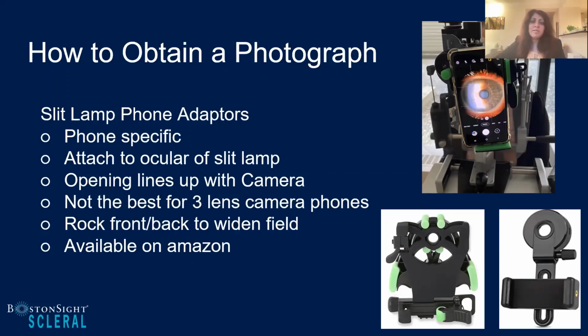And I bought a used phone that I kept in the office that was specifically meant for this setup. And I have used it for years and years and years, and it's only until recently that I got a new camera for the new office. But they work really well. And that technique of rocking, it's such a game changer. When you just lift the bottom of that whole device forward towards you a little bit, it can open up and give you such a much better view of the image that you're looking at, for sure.